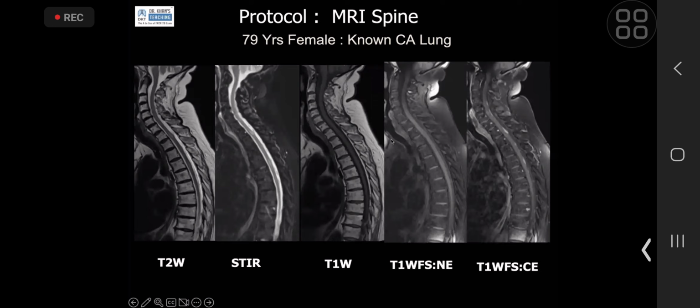Now, candidate one, the way you tackled it, you were slightly off your final because you did not ask for a pre-contrast. You should have asked for pre-contrast, and then you would have understood the diagnosis. So that will be my feedback for you.